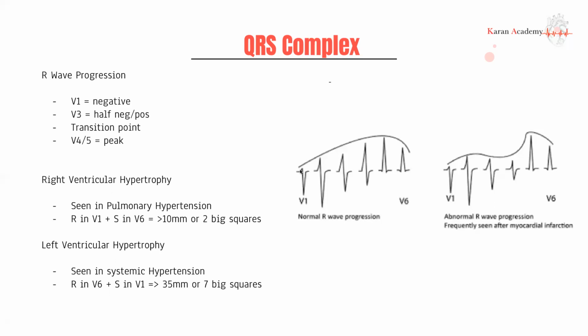I hope at this point you're thinking to yourself, well, we know that the left ventricle is going to be more near V6, which is why we're getting the tall R waves. So if there's more ventricle, we'd probably get taller R waves in V6, and you'd be absolutely right. Meanwhile, you'll also be getting deeper S waves in V1, because again, of that reciprocal issue.